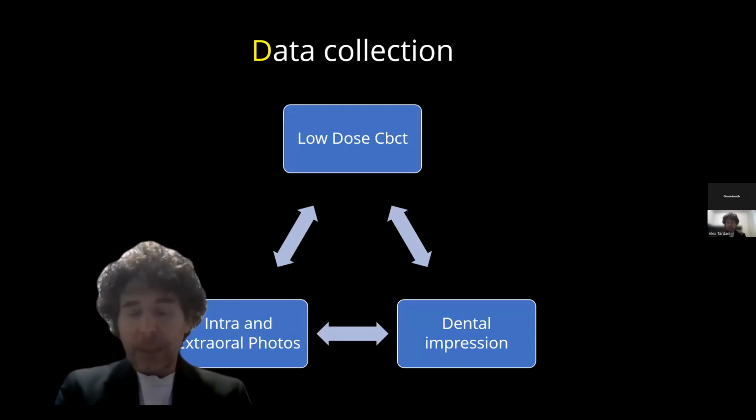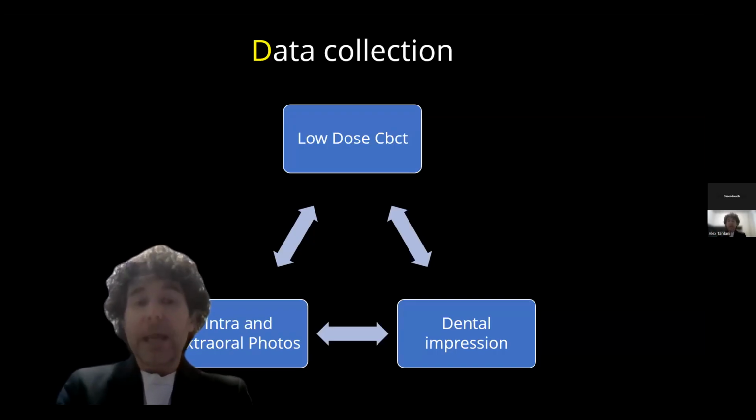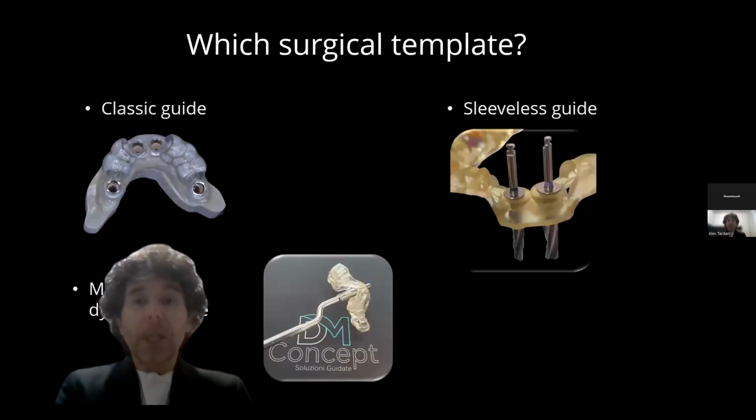Lastly, but no less important, are intra- and extraoral photos. Obviously, the extraoral photo becomes more valuable, especially when we are performing a full rehabilitation or one in the anterior zone, and it may lose some importance when we are doing simpler work, perhaps only in the posterior areas. So, let's get to the main point.